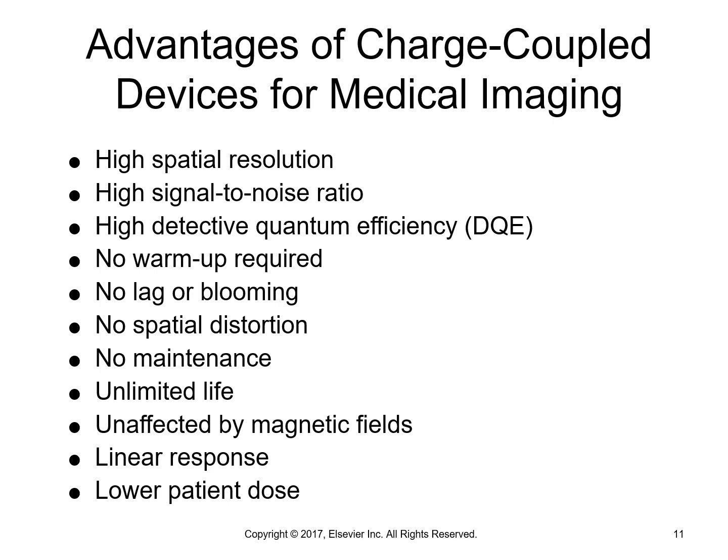It's very much molecular or atomic engineering that is happening with the CCD, but then it returns to a ground state at the tail end of the exposure. And so the CCD is basically not corroding or wearing out. Well, it's a machine, so it wears out because it's got moving parts and there's friction. No, none of that is happening in a CCD. So it's extremely durable. Okay.